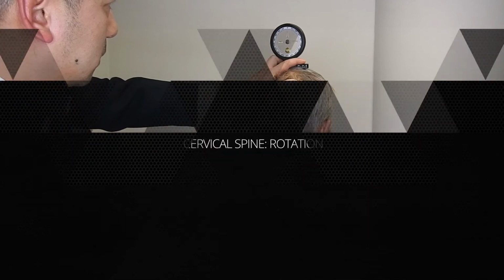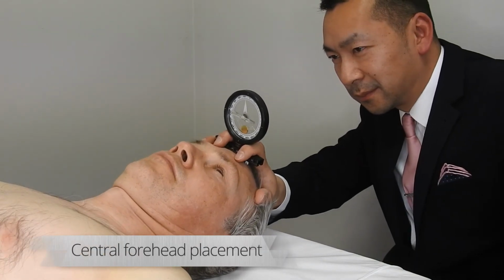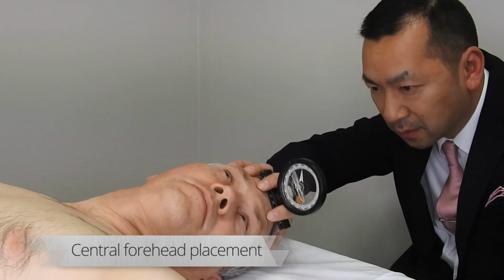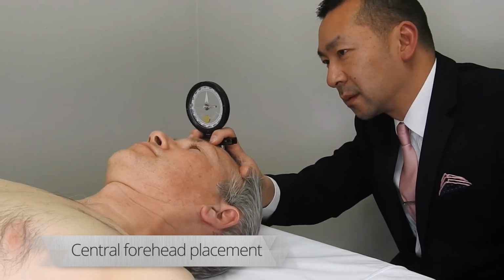Cervical spine rotation. A single inclinometer is placed on the forehead. Ensure the shoulders are stabilized and do not move. Degrees of rotation is read directly.